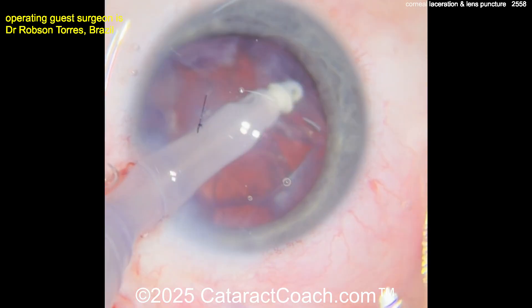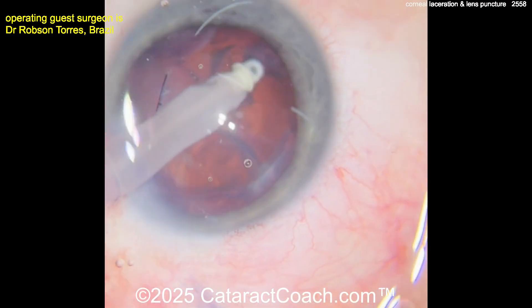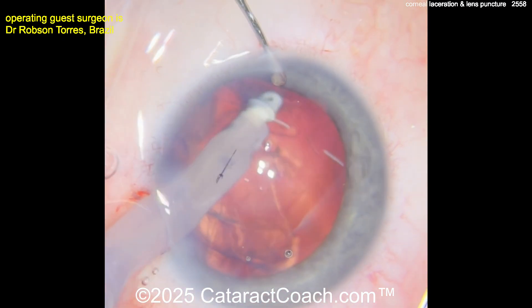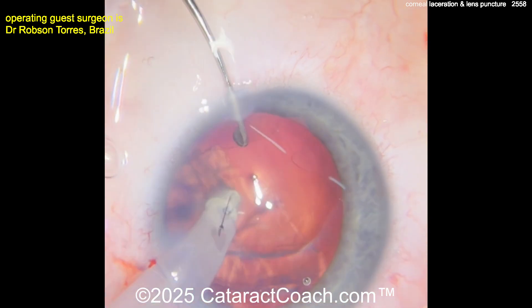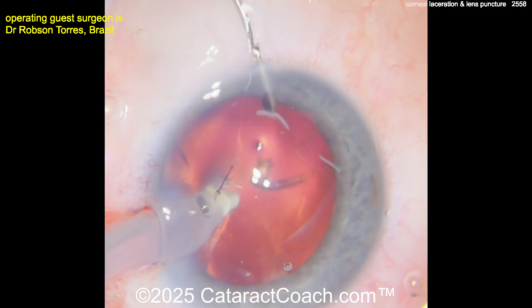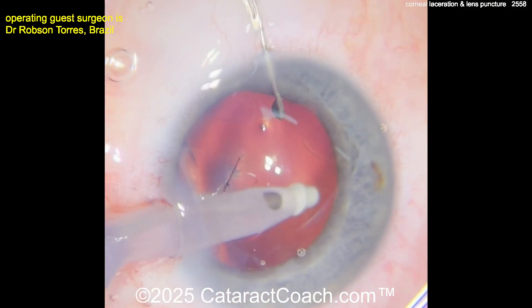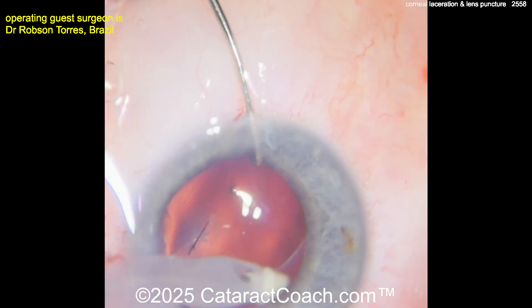For the lens calculations, I would use the other eye's IOL calculations and maybe add a half diopter just to ensure the patient doesn't end up too hyperopic. Depending on the patient's work — if they're a construction worker, perhaps add one diopter for a little more myopia, since the patient needs to see up close. At the end, be very careful — a bimanual IA is sometimes easier because you don't want to inadvertently grab the anterior lens capsule where it ran out. You can see the area between the paracentesis and the main incision where it has run out.